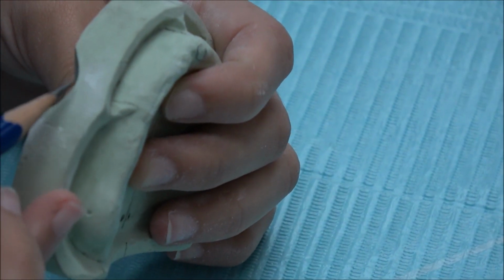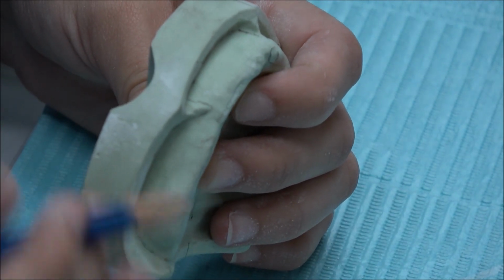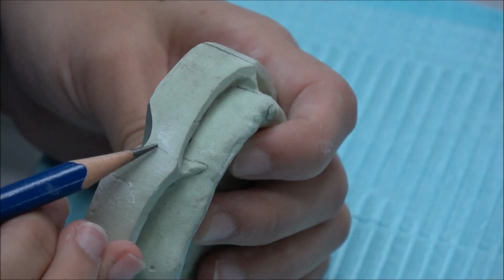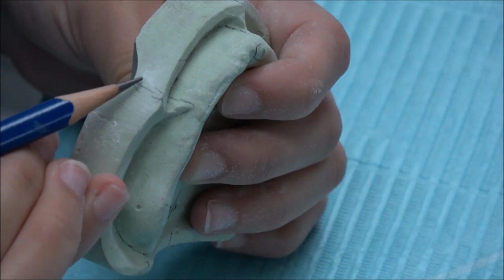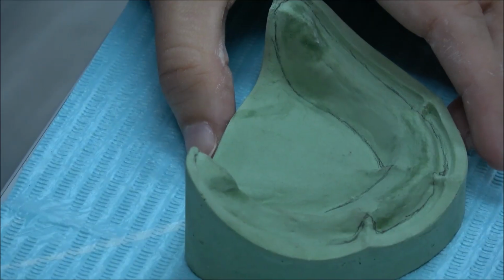Because I realize some of the students, the base is not proper, they never follow the theory. So there is something a bit thin. We have to make sure of the thickness here. Don't make it too thin, later your model will pecah. Okay? Same goes to the lower models.